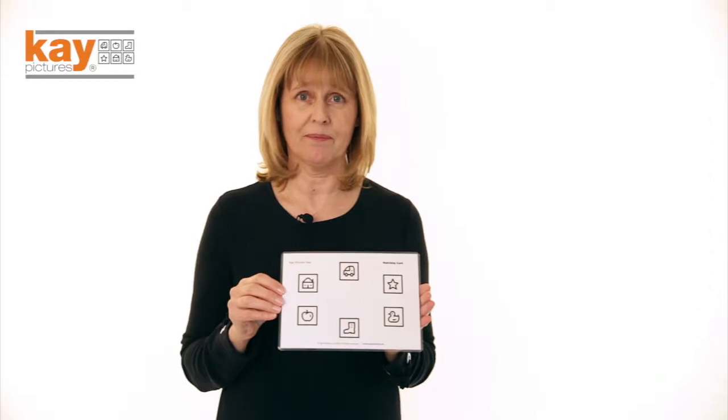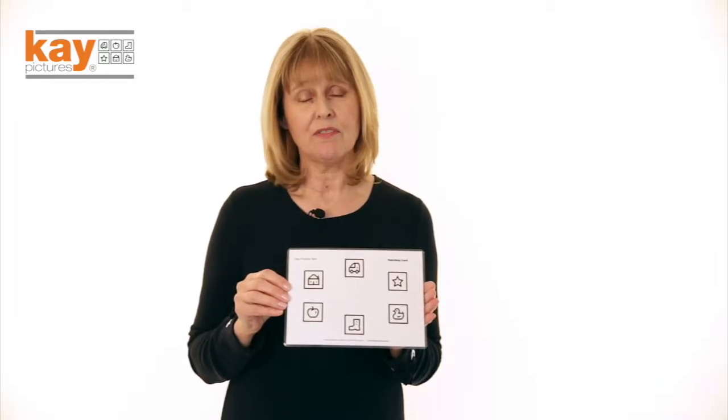Before you begin testing, show the pictures close up and ask the child to name them, and then you can hear the words they use for each picture. They may say sounds such as quack for duck. If the child isn't particularly talkative, you can give them the card and ask them to point to each optotype. If the child uses sign language, these pictures are really easy to sign.